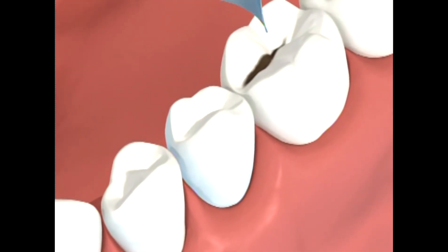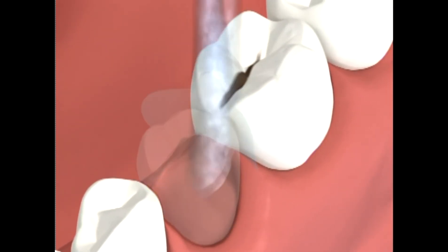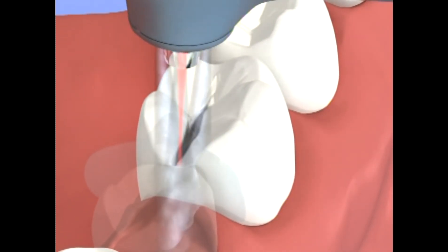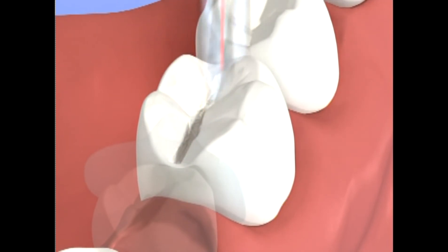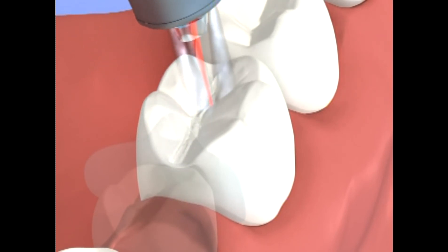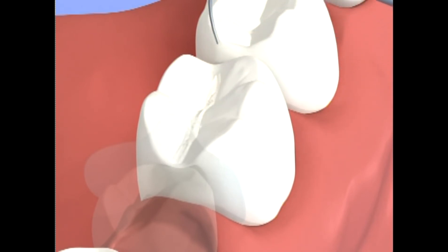A matrix band around the adjacent tooth is recommended for protection. To start the cavity prep, open the groove and seek the decay first by aiming the laser toward the lingual cusp with the tip tilted at approximately 10 to 15 degrees. Frequently stop to check the cutting depth and adjust the power or focus-defocus accordingly. After you open the fissure to remove decay, check with an explorer to see if the tissue is soft. Continue to remove tooth structure if necessary.